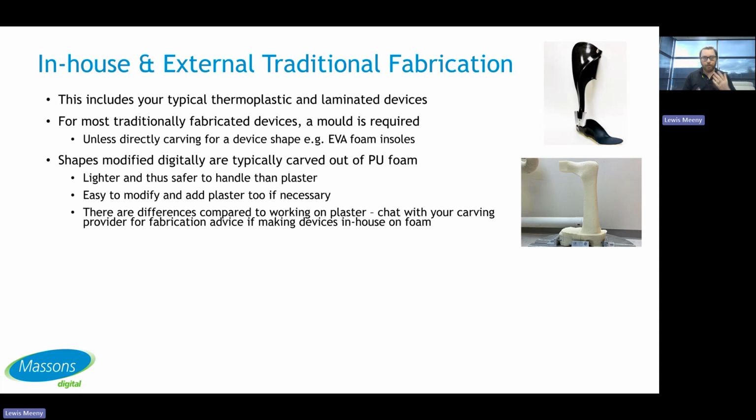So compared to working on plaster versus working on foam, maybe chat with your carving provider for some fabrication advice, especially if you've never done this before. Sometimes the foam just behaves in a little bit of a different way to plaster, so you'll just need to change up your process a little bit. But there are several facilities out there working purely on foam and having no issues.